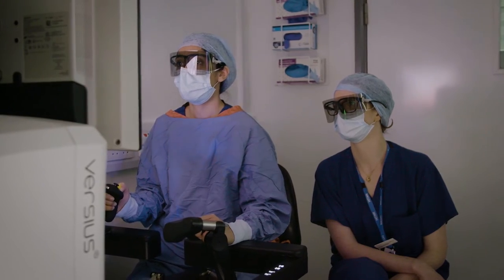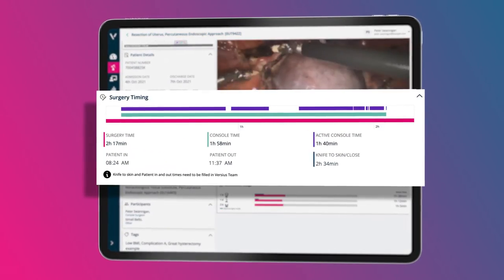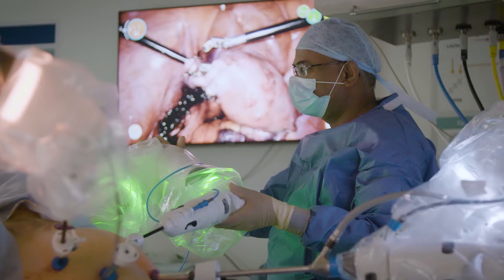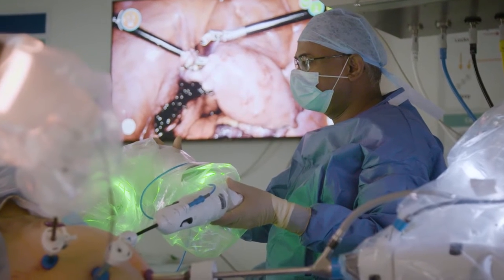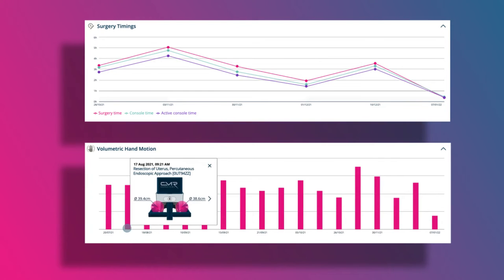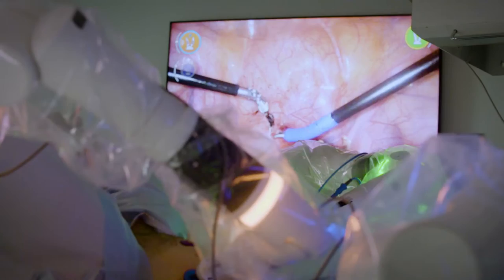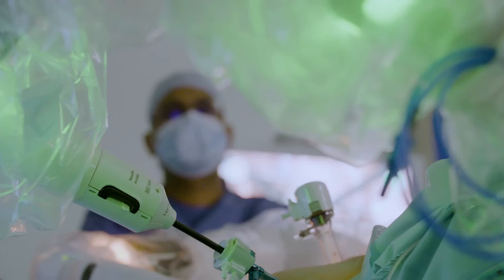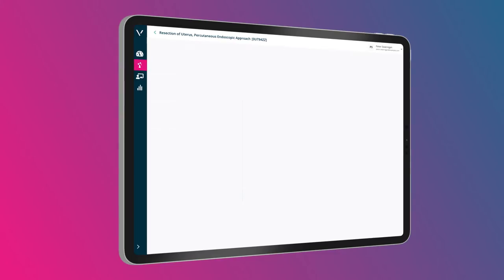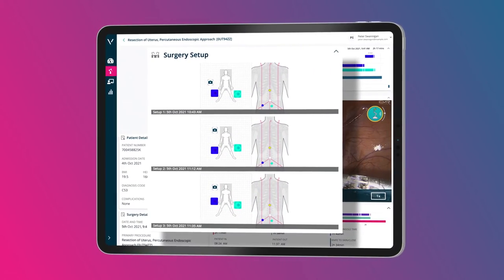Understand your OR efficiencies through detailed console usage timelines. See how you performed by understanding key trends, including Versius console usage and hand motion over time — helping you learn and optimize your future OR workflow by logging your setups from every case.